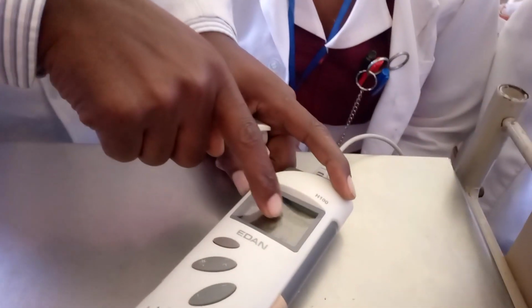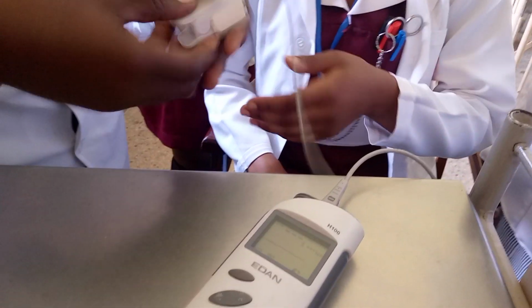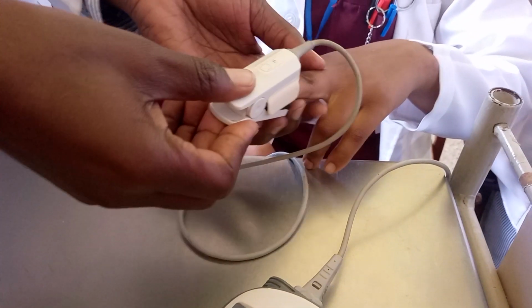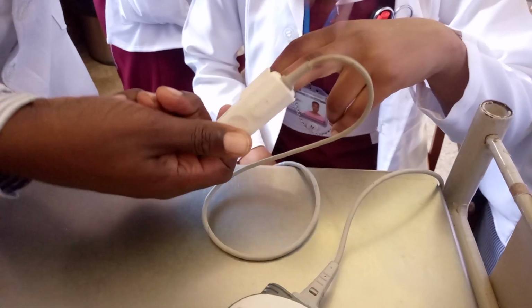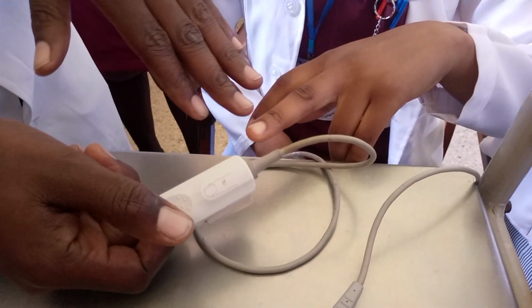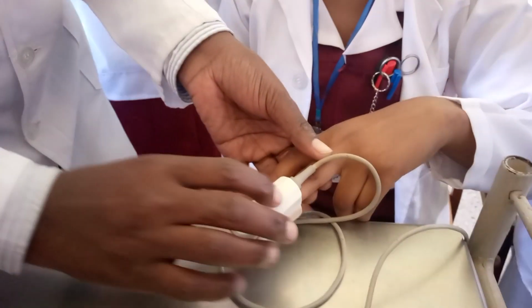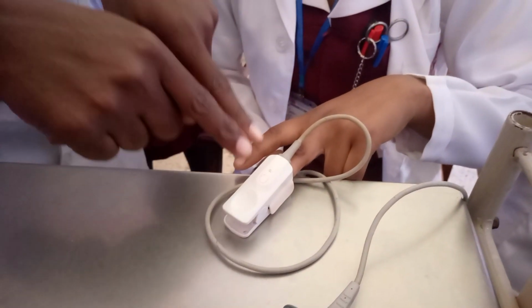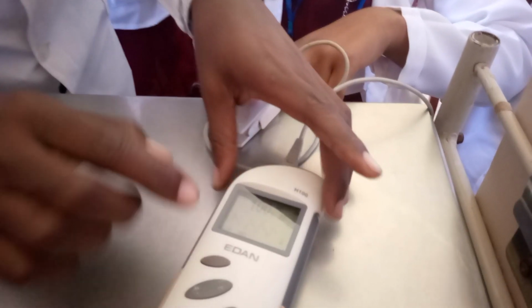This line is what we call the waveform. Let's see the waveform first. Okay, Lydia, just give us your finger and place it there. The light, as you can see, is penetrating through the skin. Ensure that the patient's nails are not coated with nail polish and are clean, so that it gives you a reading. Once you do that, the infrared light will be able to get through the skin, and what you'll be able to see is this waveform.